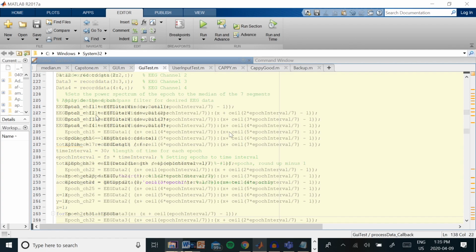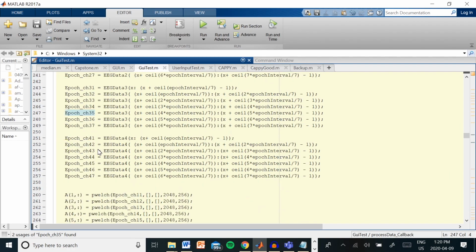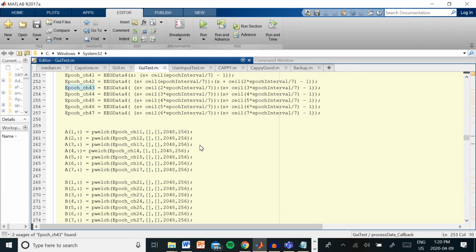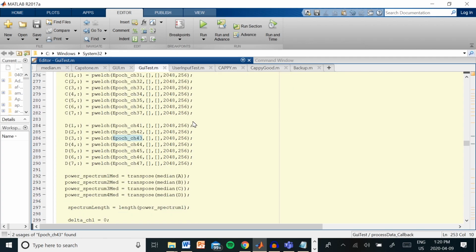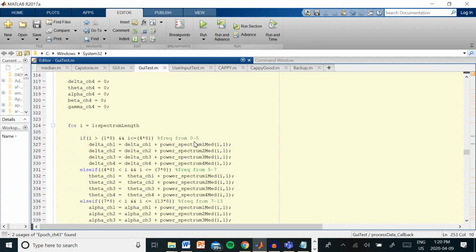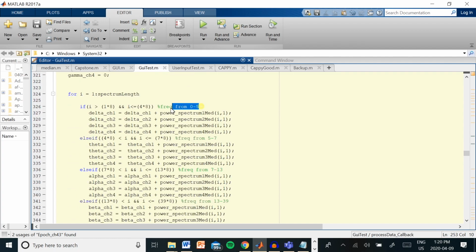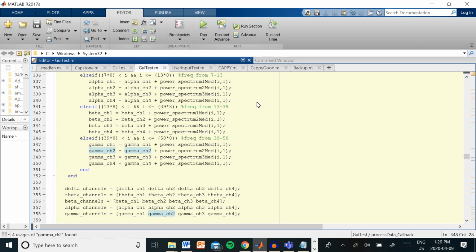The data is then separated into 30-second epochs, and the power spectral density is calculated for each. A power spectral density, PSD, describes the distribution of power in the frequency components composing that signal. We then take the PSD and chop it up to give us the distribution of power for the brain waves delta, theta, alpha, beta, and gamma, which each have their own frequency range.